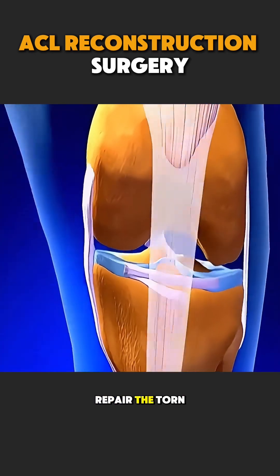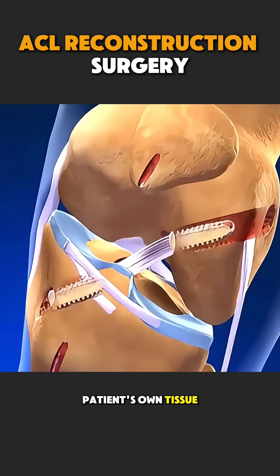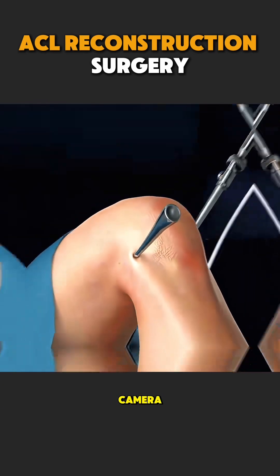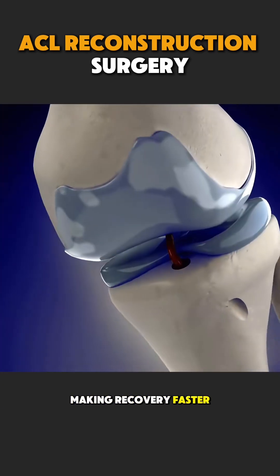In ACL reconstruction surgery, doctors do not repair the torn ligament. Instead, they replace it with a new ligament made from the patient's own tissue or a donor tendon. The surgery is done using a camera and small instruments through tiny cuts, making recovery faster and safer.